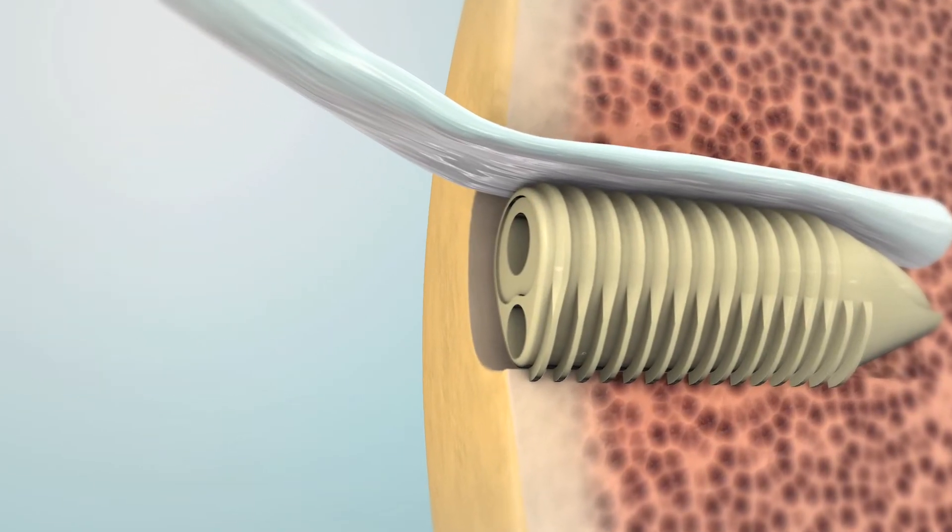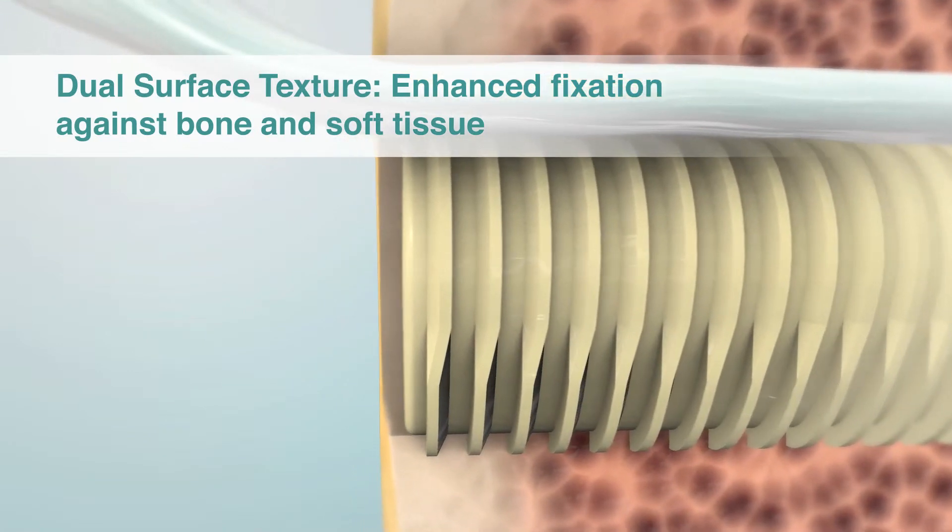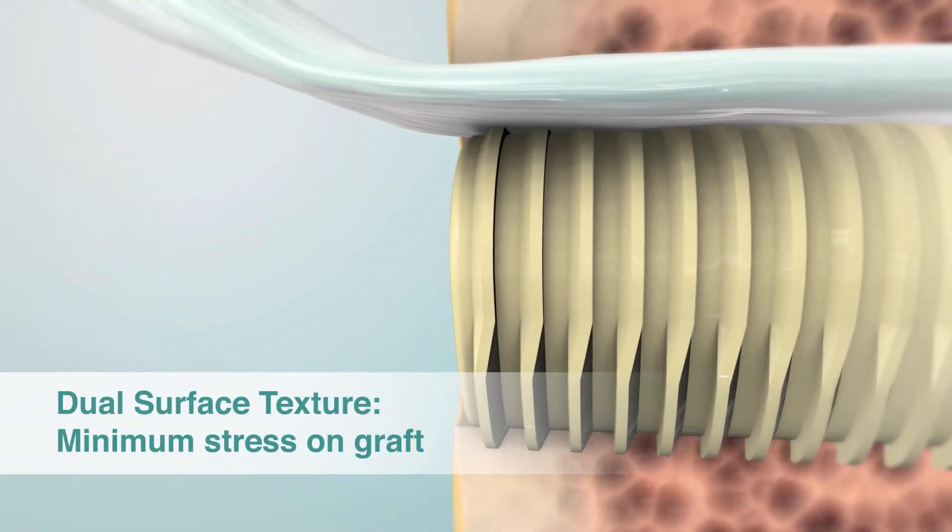The dual surface texture of the sheath provides secure fixation against bone and soft tissue, with minimal damage to the tissue.